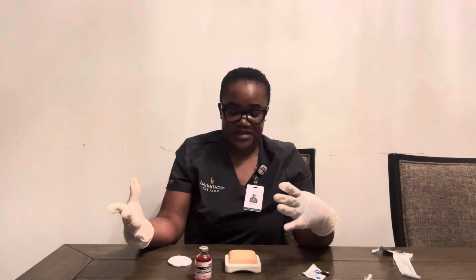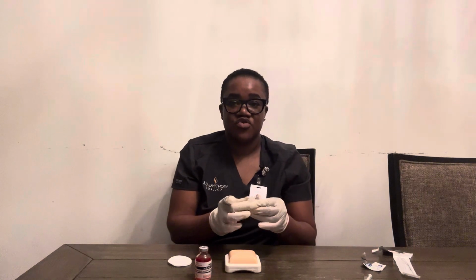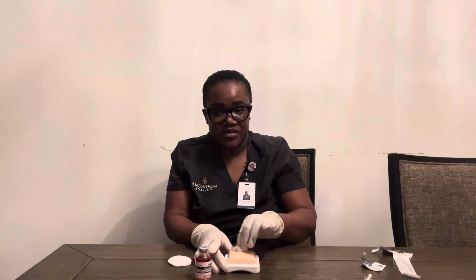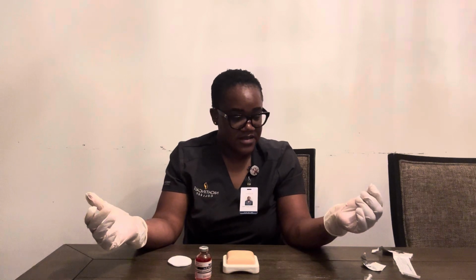I'm gonna assess my skin for any lesion, any skin discoloration, any edema, any tenderness. And after I do that, I'm gonna clean the site with my alcohol prep pad. I'm gonna clean in a circular motion from inside out, and I'm gonna clean about 5 centimeters. I'm gonna allow this to air dry without fanning or blowing it, and then I'm gonna take my needle.